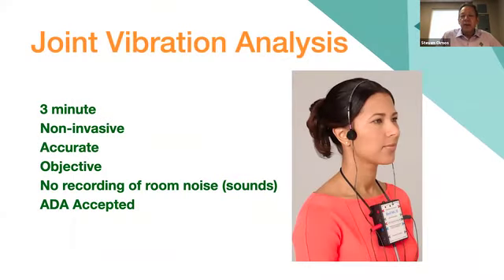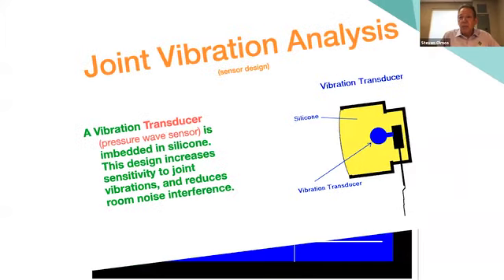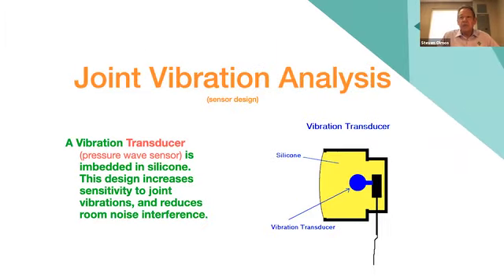And so this is a very simple technique. We're measuring vibration. Normally, a joint should move very smoothly, with synovial fluid in between the cartilage represented in the top here. So very little vibrations. However, when cartilage and loss of synovial fluid produces a roughened surface, or when it gets to the point where it's perforated and you have osseous contacts, we can record those vibrations. So we'll know a lot more information about the health of the hard and soft tissue even before it'll show up on an x-ray.